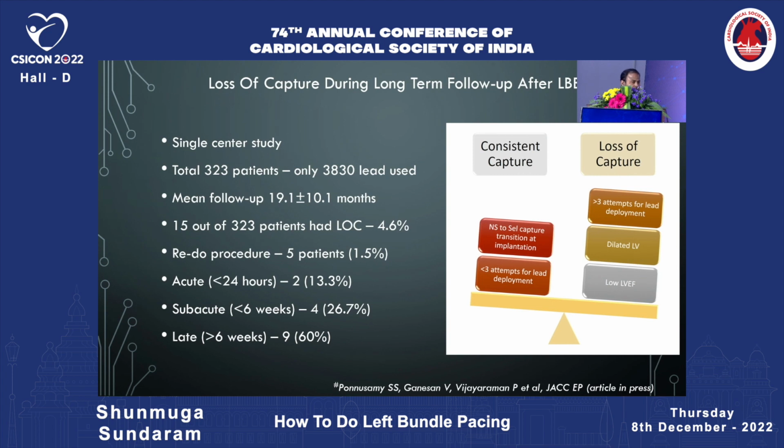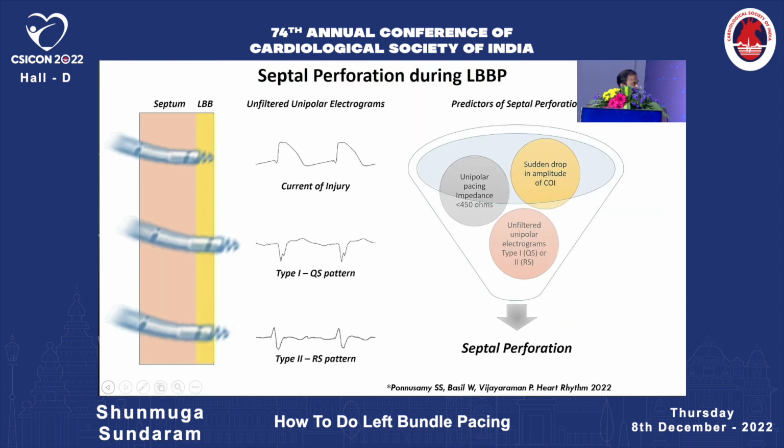So you have to monitor the patient thoroughly during the follow-up, both electrocardiographically and by doing a PSA analyzer. And for patients with an LV dysfunction, look for echocardiographic improvements as well as for the lead depth.